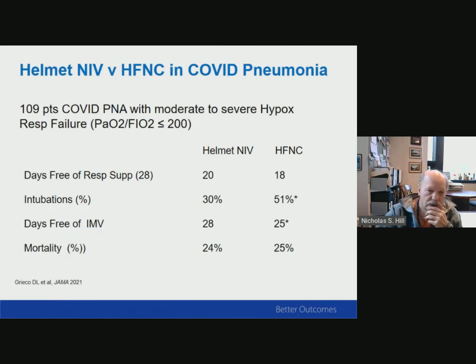The one randomized controlled study that has been published thus far on non-invasive techniques is this one by Grieco et al., published in JAMA. What they showed, randomizing helmet NIV versus high flow, was that there were fewer intubations with the helmet, but overall mortality rates didn't differ.